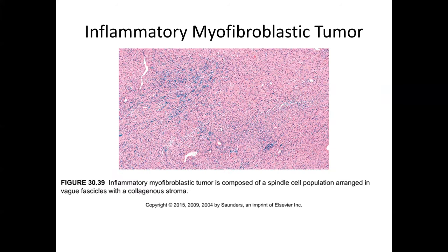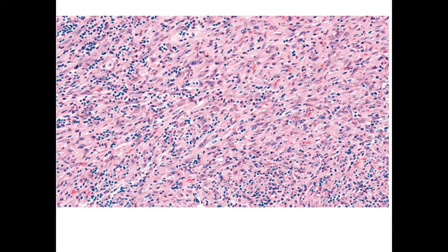In the differential with intra-abdominal desmoid is inflammatory myofibroblastic tumor, which tends to have more inflammatory component but may also have a spindle cell process. It tends to be a bit more eosinophilic and a little more fibrotic than fibromatosis. You can see the mixed character of the inflammatory process along with the spindle cell characteristics. Many of these tumors would be positive for ALK protein on immunohistochemistry, and you might also see myofibroblastic markers like desmin or smooth muscle actin.